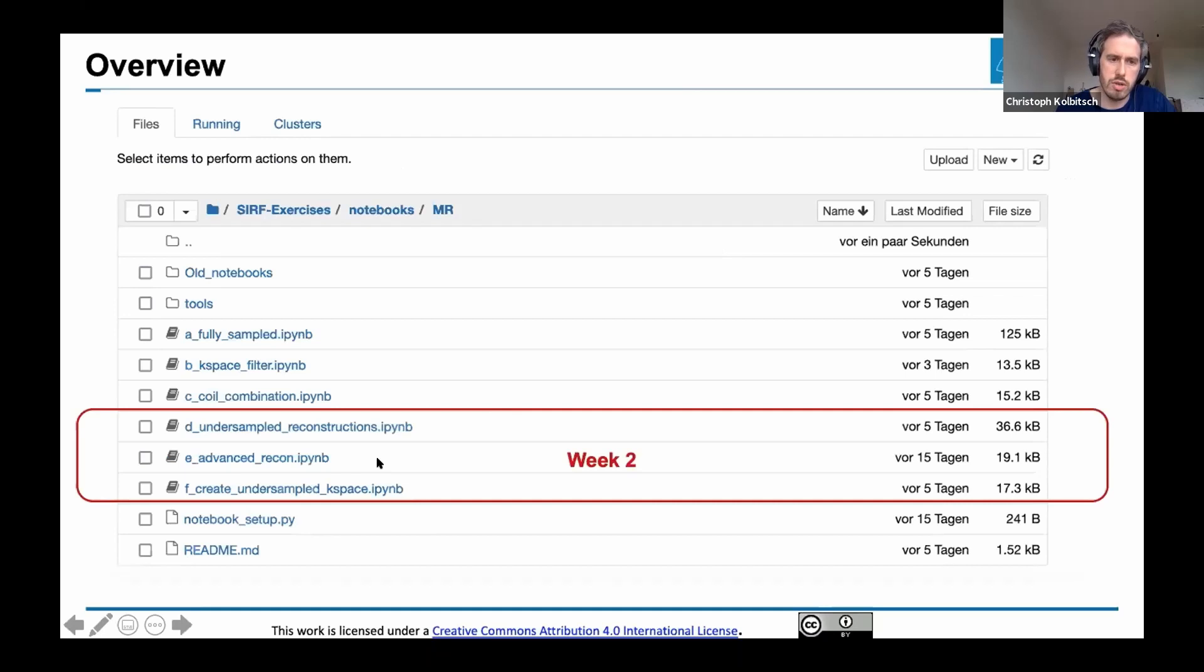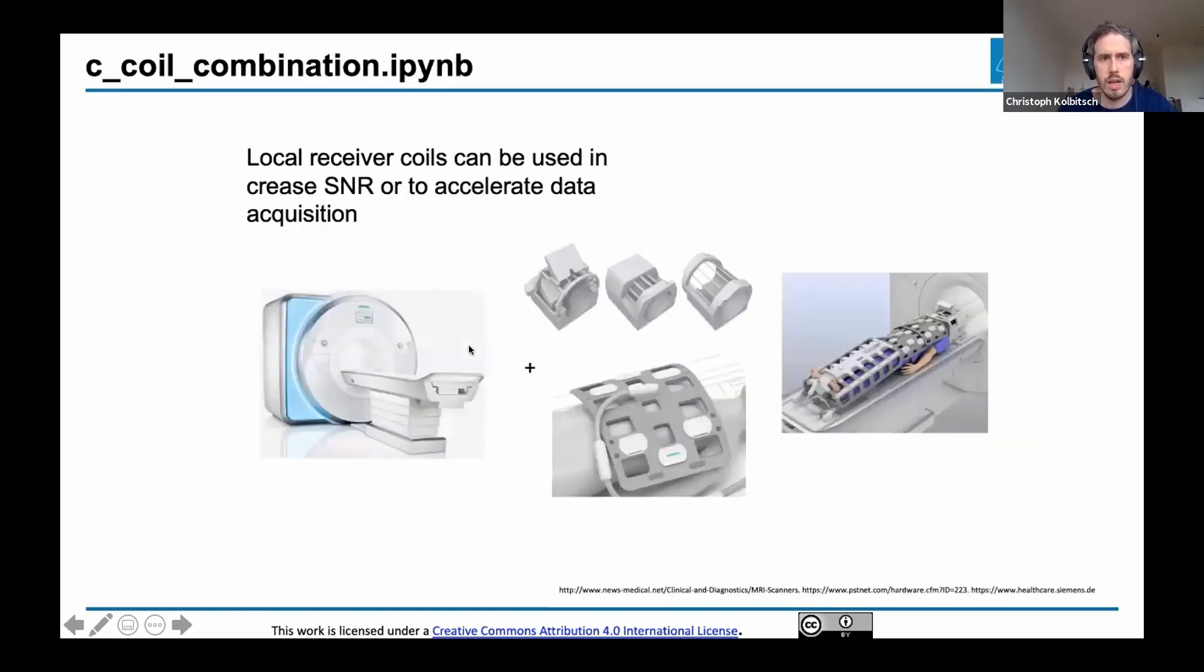For this week, the second week, we move on to iterative reconstruction. It's all about undersampled reconstructions and how we can get good image quality. There are three notebooks: undersampled, advanced recon, and create undersampled k-space, which shows more tools needed for the third week when we do synergistic image reconstruction.